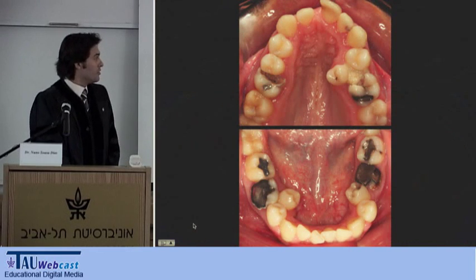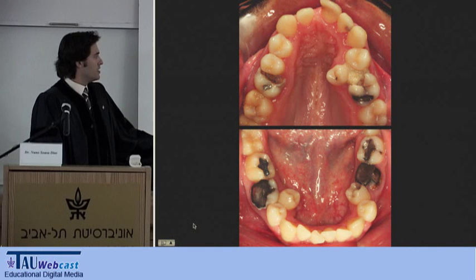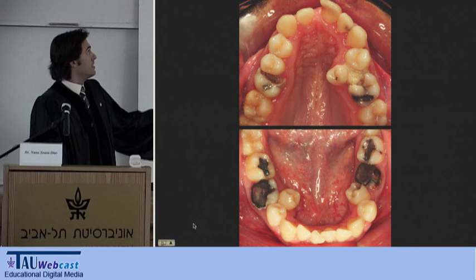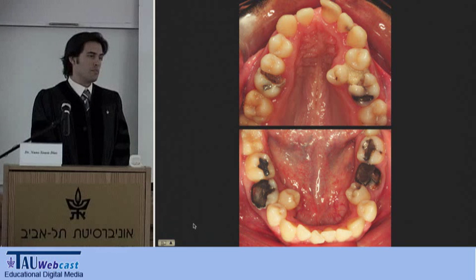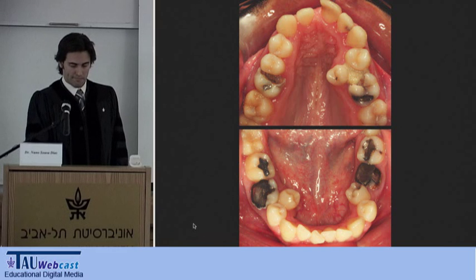So this is the occlusal view. The patient came to me like this, with first molars in this condition. We have some premolars that are blocked in. They should be in this position, making an arch form. We have some crowded in the anterior teeth. We have the missing central incisor, lack of space. Again, very bad condition, very bad oral hygiene, a lot of problems. And the patient was not motivated at all. He came the first time with a sister, and he was not motivated.